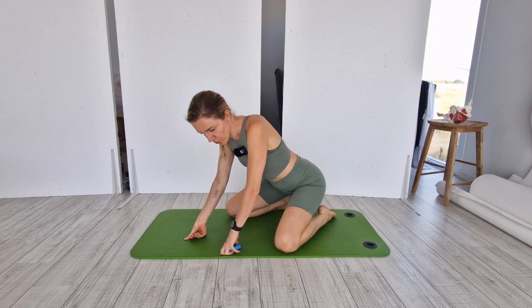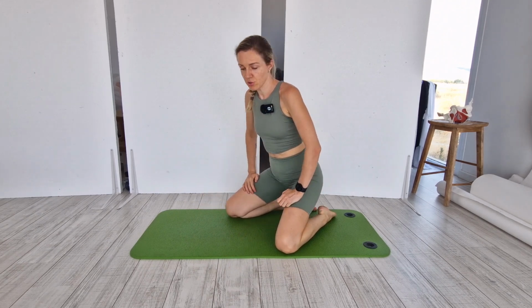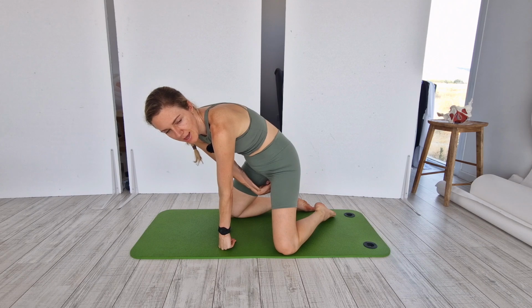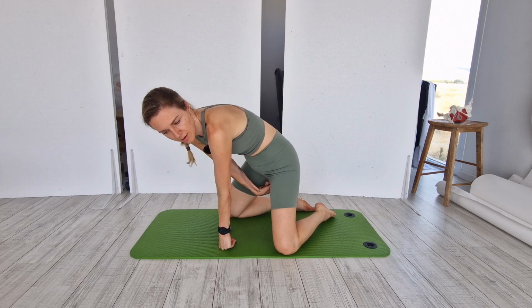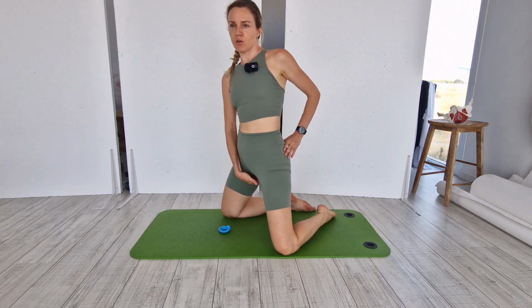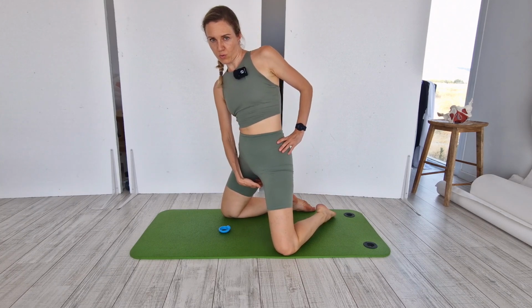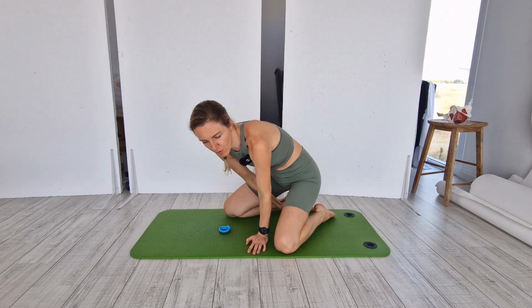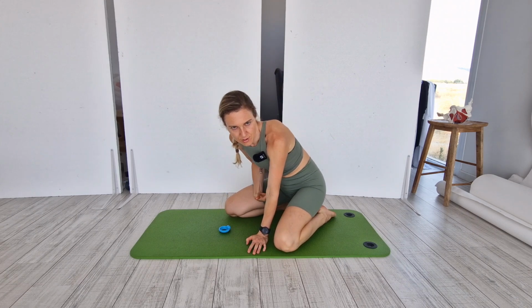Sometimes you will need gravity to assist you in removing the pessary, so you don't have to lie down. You can go onto a kneeling position or high kneeling position. So you go into the vaginal canal, and again you try to go forward, upward, arching your back. The straighter you go, the more you have to move your upper body. The lower you are, the more length you have.